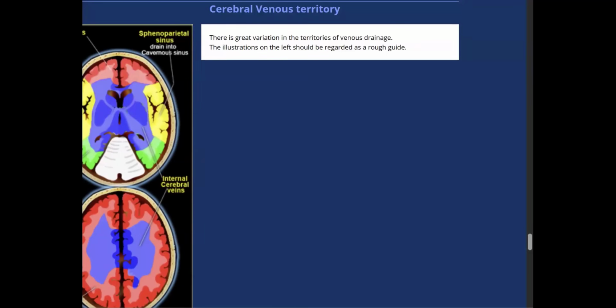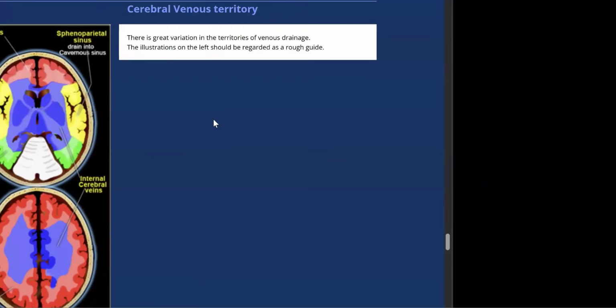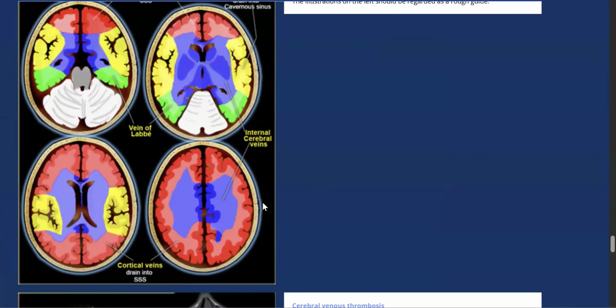And remember, my friends, if there is an infarction that doesn't follow the arterial territory, it may be venous. Venous infarctions follow venous territories as well, especially if the infarction is bilateral. Bilateral thalamic infarction: look at the internal cerebral veins. Bilateral parasagittal infarctions: look at the superior sagittal sinus. Atypical temporal infarction can be related to the transverse sinus or the cortical veins. Excellent, my friend.